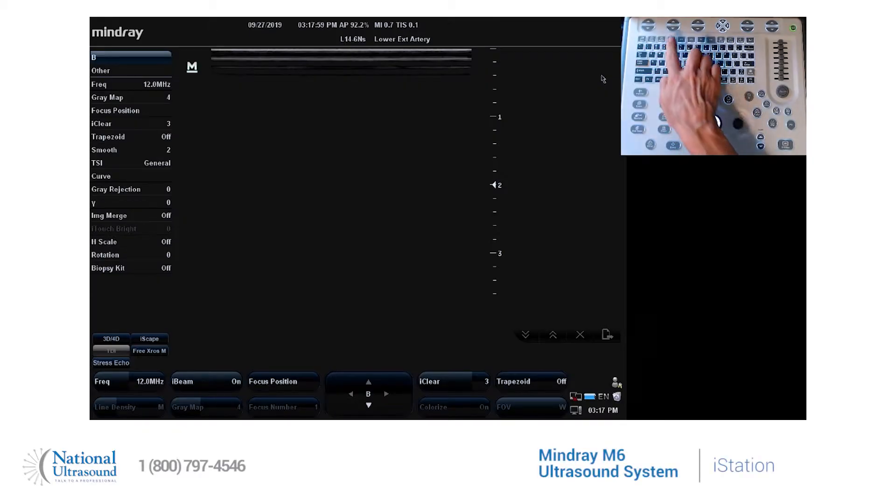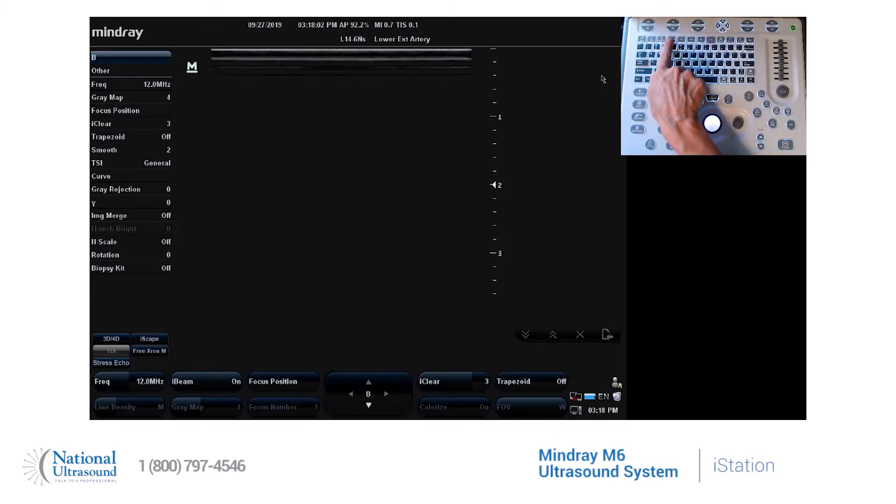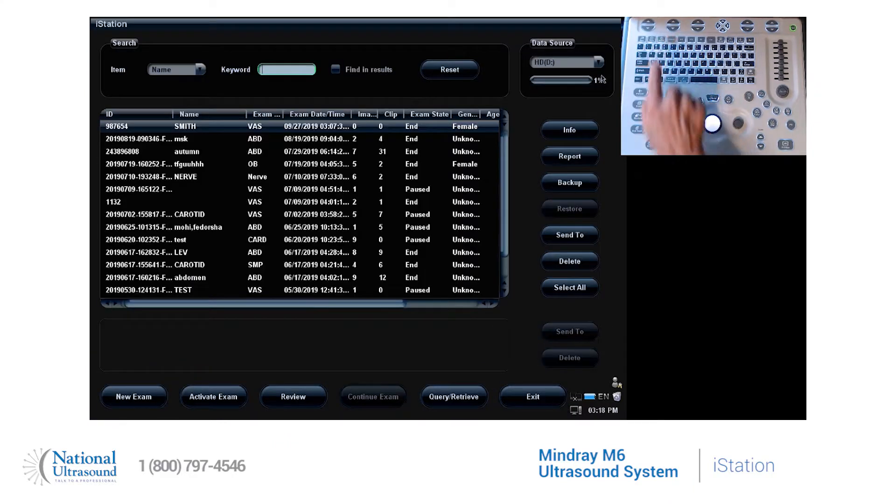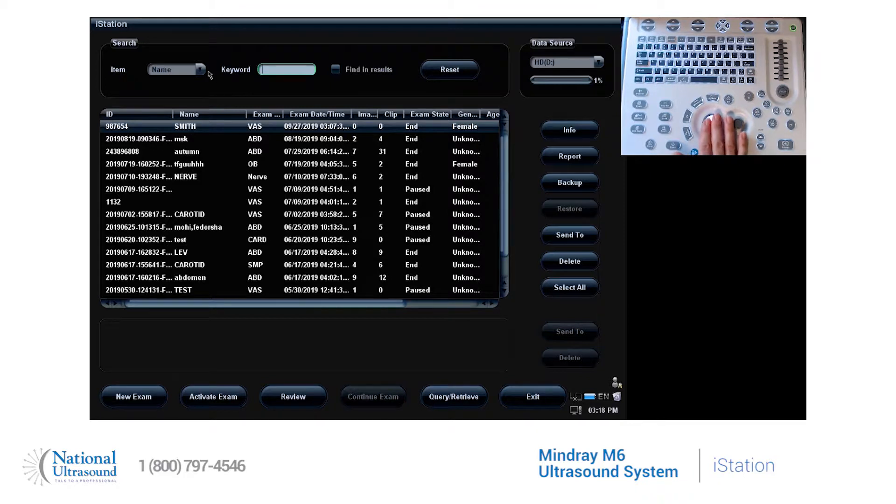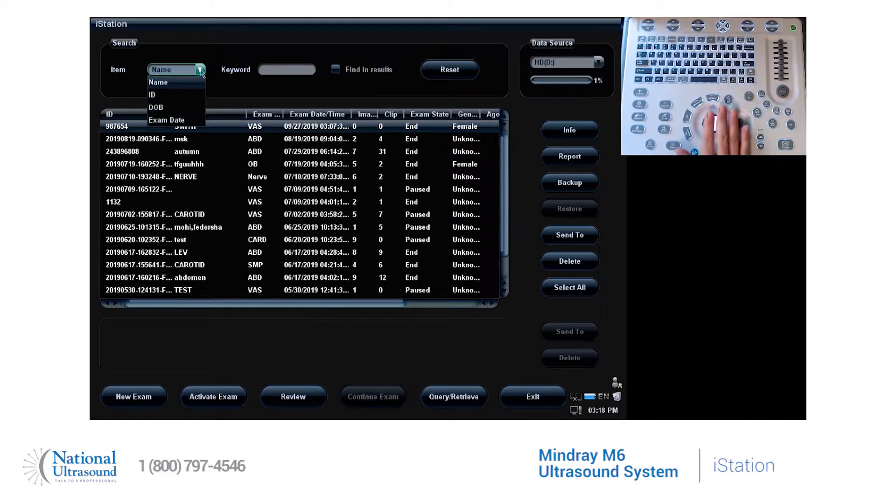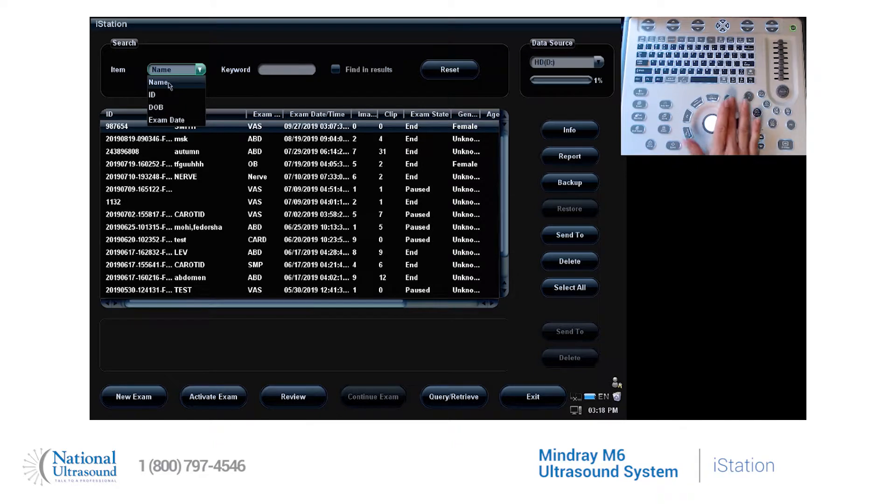The hard drive of the M6 is called iStation, designated on the button on the top row of your keyboard. Once in iStation, it is easy to search for a particular study by clicking on the drop-down menu, choosing the method by which you want to search.